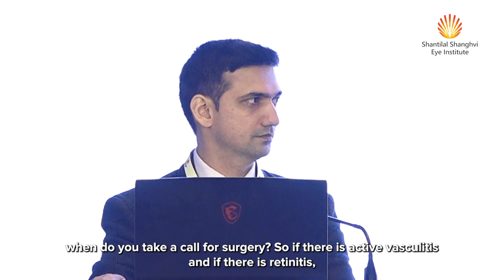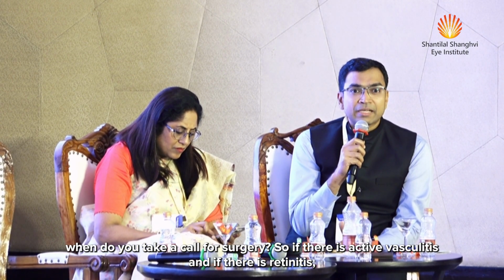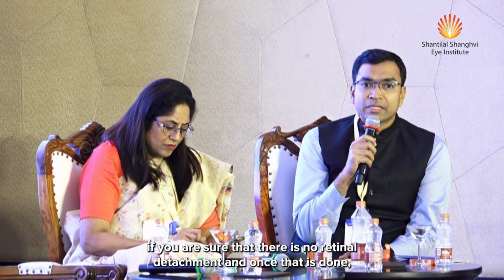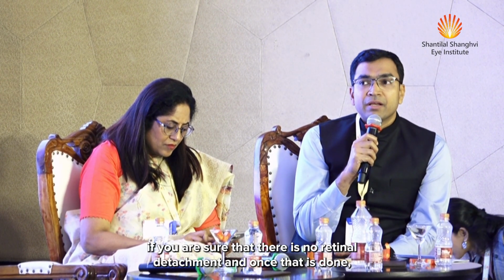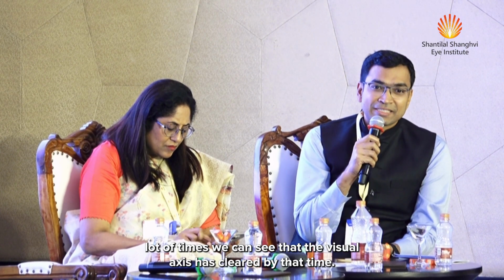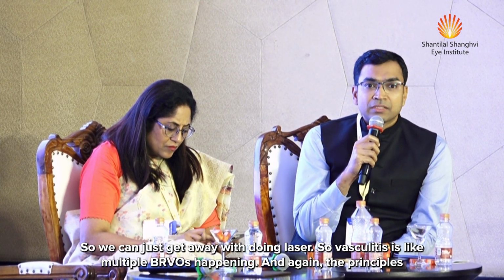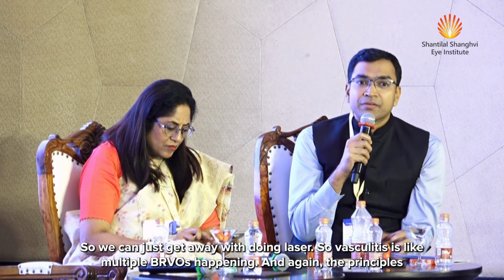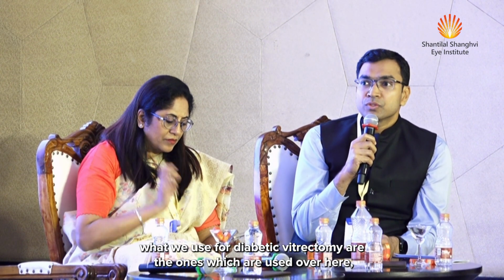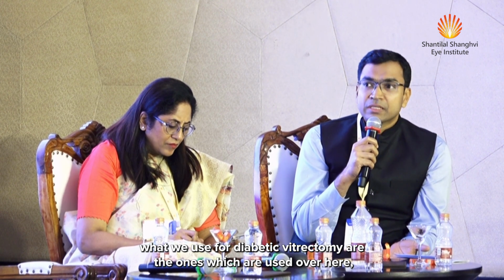So, if there is active vasculitis and if there is retinitis, we would want the inflammation to get under control if we are sure that there is no retinal detachment. And once that is done, a lot of times we can see that the visual axis has cleared by that time. So we can just get away with doing laser. So vasculitis is like multiple BRVOs happening. And again, the principles we use for diabetic vitrectomy are the ones used over here.